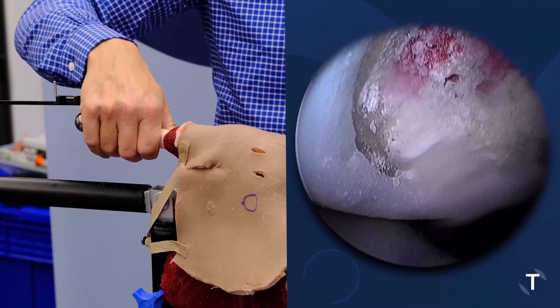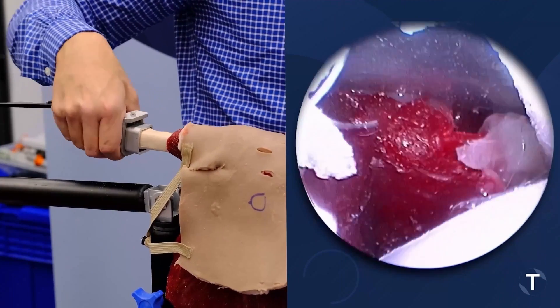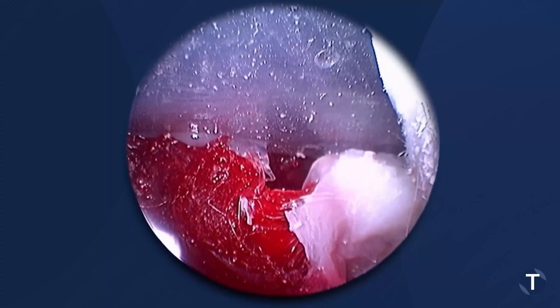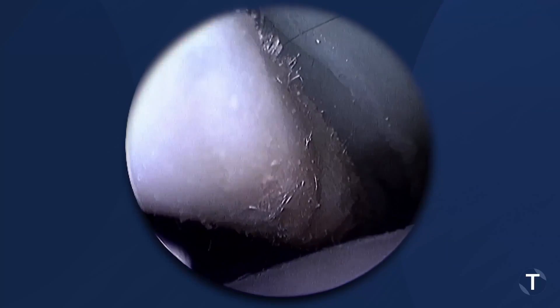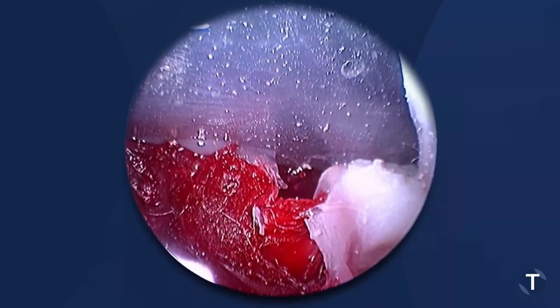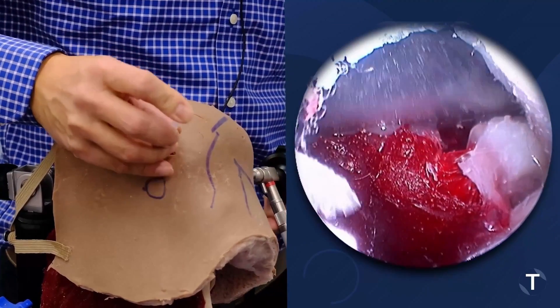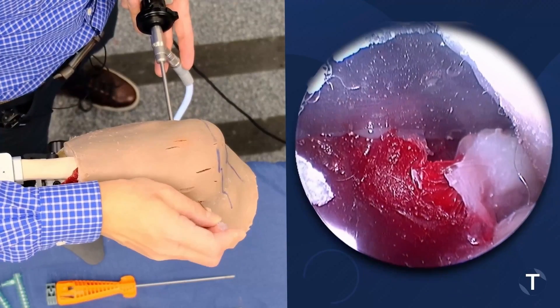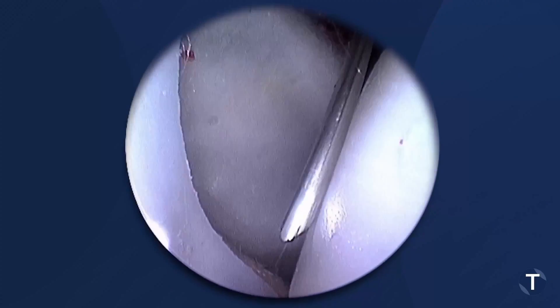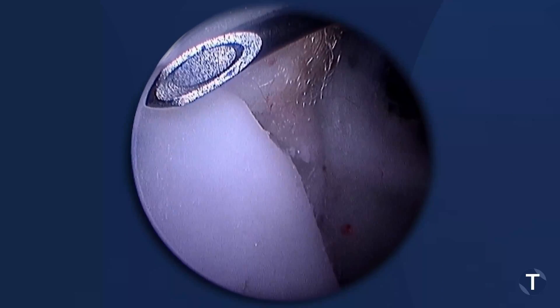We can bring the arm out. You can see the upper border of the subscapularis here. There's our rotator interval — the clear rotator interval that extends up behind the biceps tendon to the leading edge of the subscapularis. That's our triangle where we want to put our anterior portal to make sure we can get down to our glenoid and up towards our superior labrum, which we can.